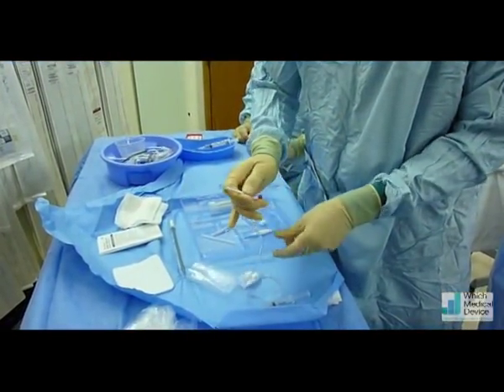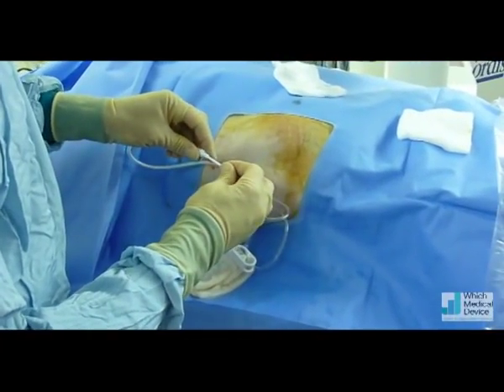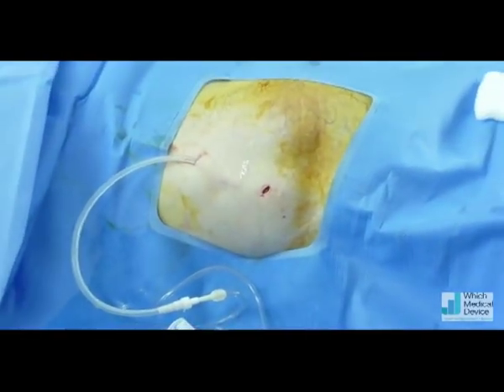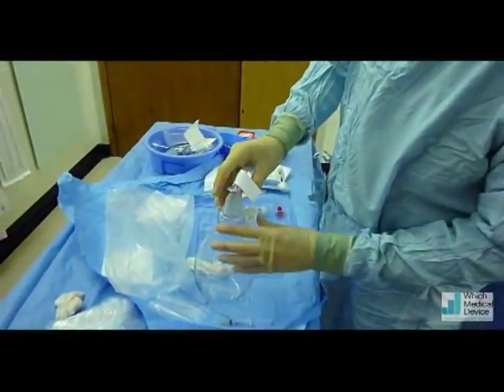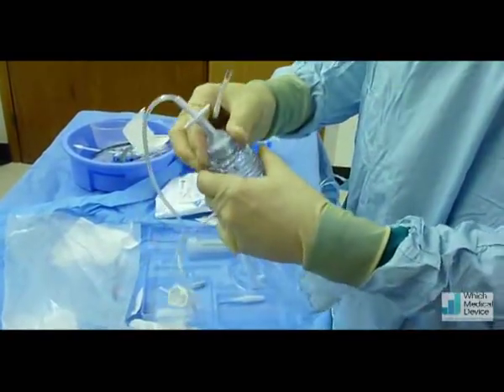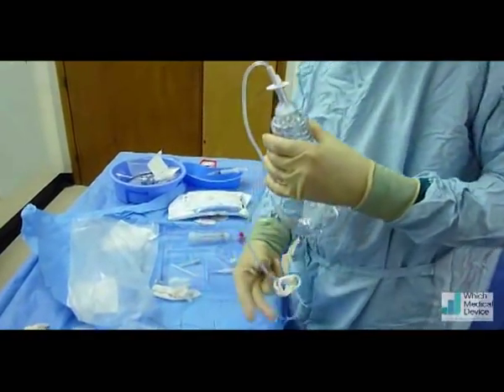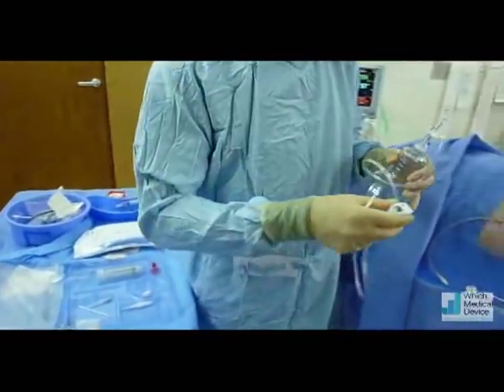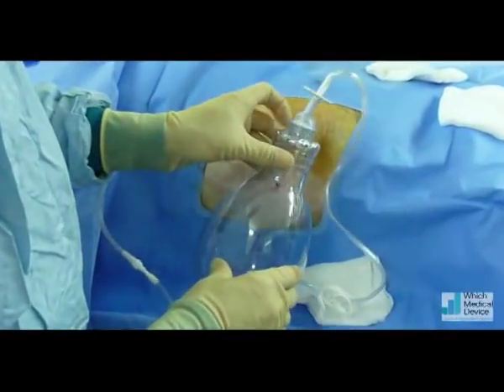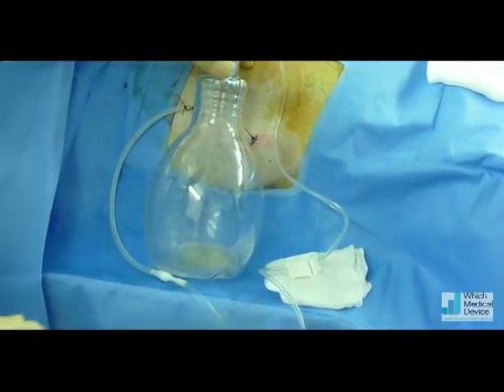This is the connection tubing that goes into the PleurX drain. The end of the PleurX drain has a valve, and this goes through the valve to allow for drainage — and that will drain once we open that up. This is a vacuum collection bottle; it actually comes with its own connection tubing. When this spike is plunged through the central bit, that releases the vacuum and puts suction onto the drain. Just going to take the cover off, clamp it off for a moment, and release the valve. That vacuum has been released — when we open that, it's draining the ascites freely.